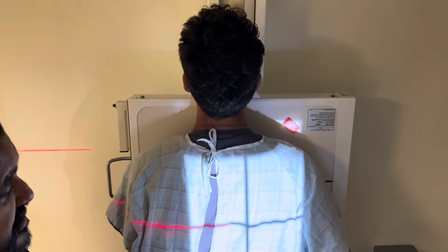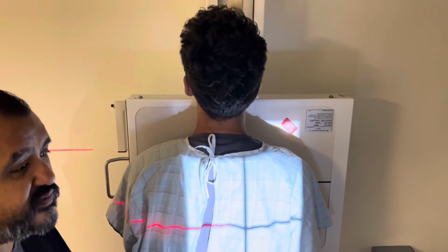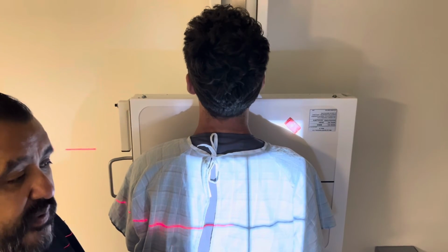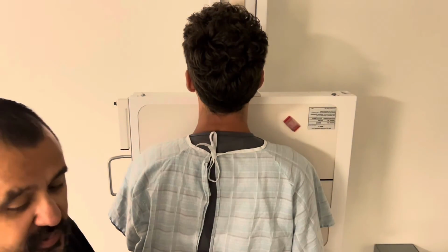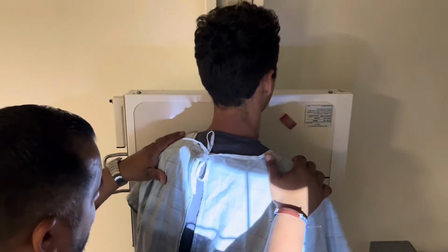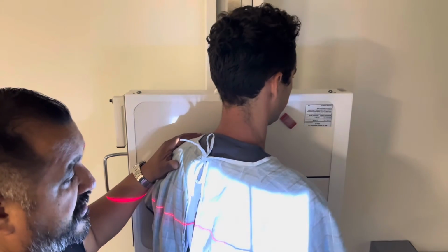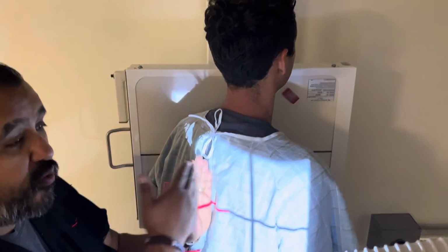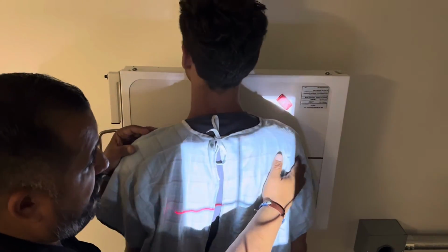All right, so now watch this. You can relax and breathe. This is where it gets a little funky. So remember that posterior obliques, we said you want the side of the injury closest to the board, correct? But when it comes to anterior obliques, A is away. Okay, so this pertains to ribs and lungs. So now we're going to turn him at an angle, 45 degrees. We're doing a left anterior oblique for the right side of his ribs. We want the spine to come away from the rib injury. So if we were to go ahead and turn him this way, look what's happening.